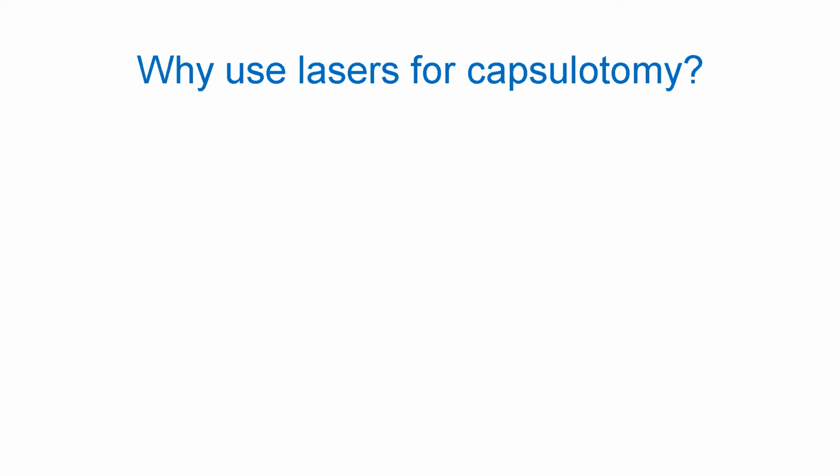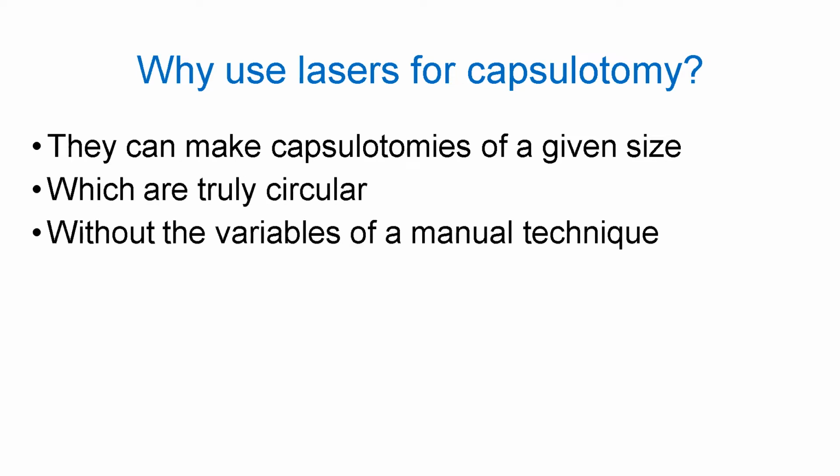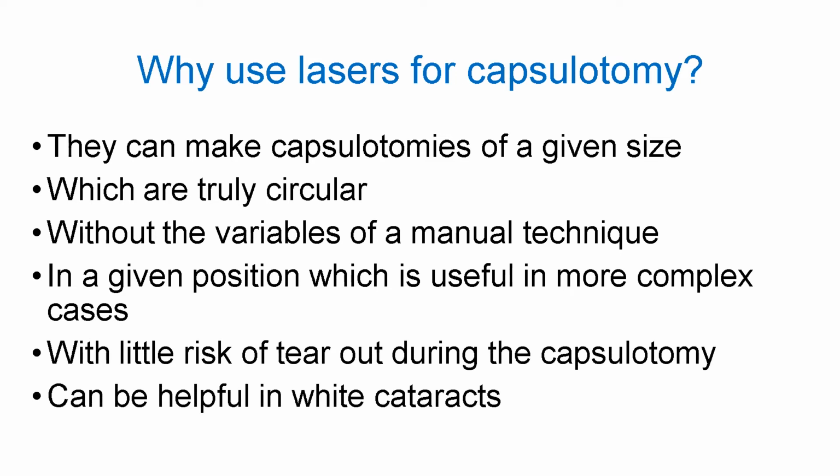So why use lasers at all for a capsulotomy? Well, they can make capsulotomies of a given size, which are truly circular, without the variables of the manual technique, as we've seen, in a given position, which can be useful for more complex cases, and with little risk of tear out during the capsulotomy. And also, they can be helpful, as we will see, in white cataracts.